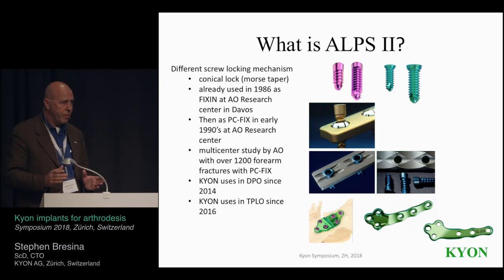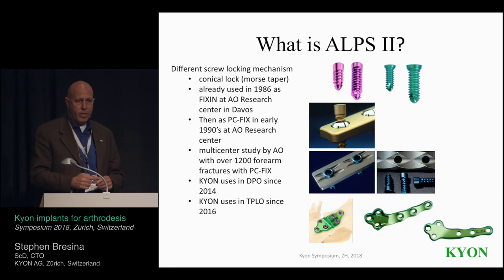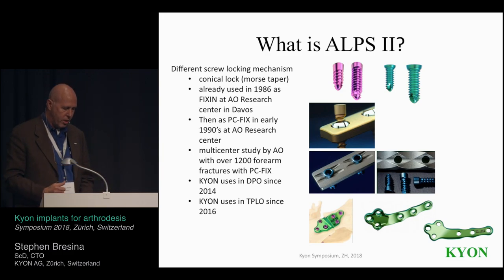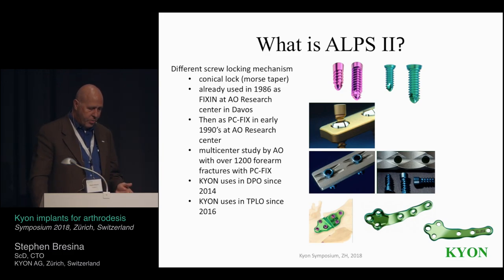It's a small difference, but it's important if you realize that, because if you do the TPO, the TPLO system, or DPO, when you put the screws in, you should go back around and tighten them all. If you have three screws in a bone segment and you tighten the first one in, then you tighten the second one and that pulls the plate a little closer to the bone, basically you have unloosened it some off the first screw. So it's important that you go back and snug the screws down to pull them all down and make sure they're all tight. So that's really the only difference.